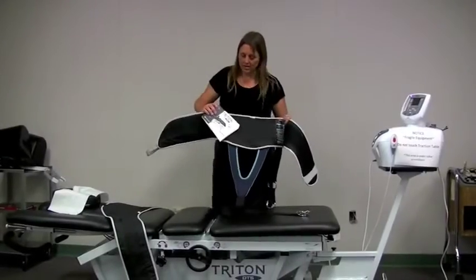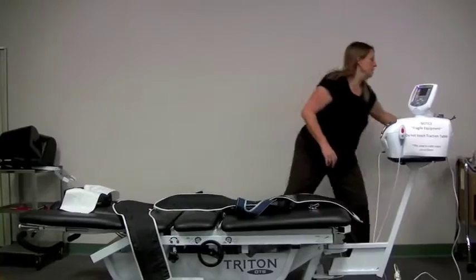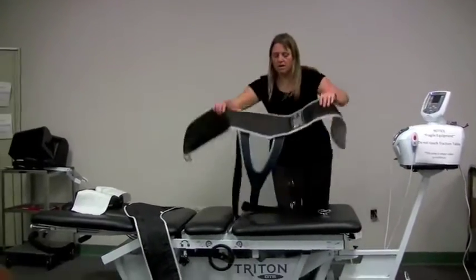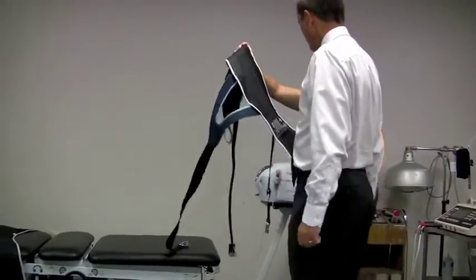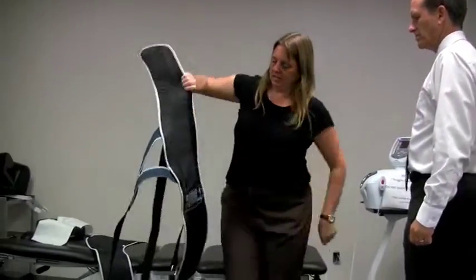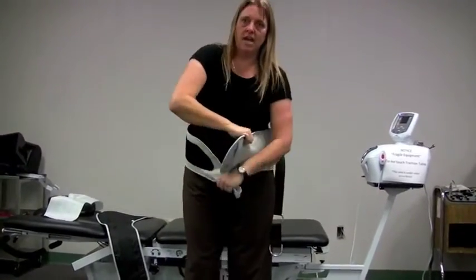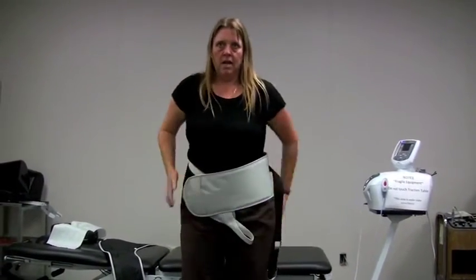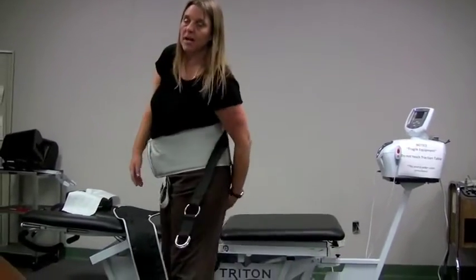So this is again the Triton table, the DTS table. I'm going to do a lumbar traction. The lumbar harness is pretty straightforward. I'm going to be putting it on a patient. I'm going to demonstrate first on me. It looks like you're rock climbing, so it's a good day. Pull down and across. And then you want to have the tail go center on the body.